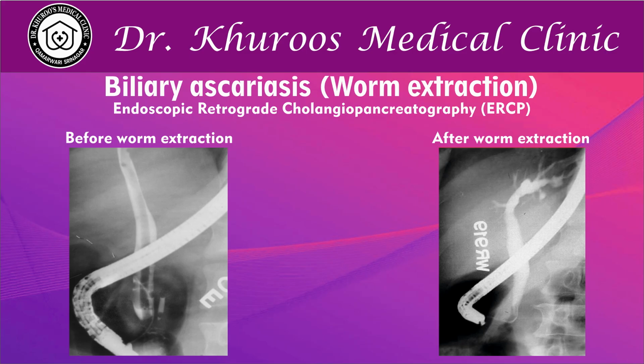Following the worm extraction, we performed a repeat cholangiogram. It showed no filling defect, suggesting the worm had been successfully extracted from the bile duct. Following worm extraction, the patient had rapid relief of biliary pain and resolution of cholangitis.